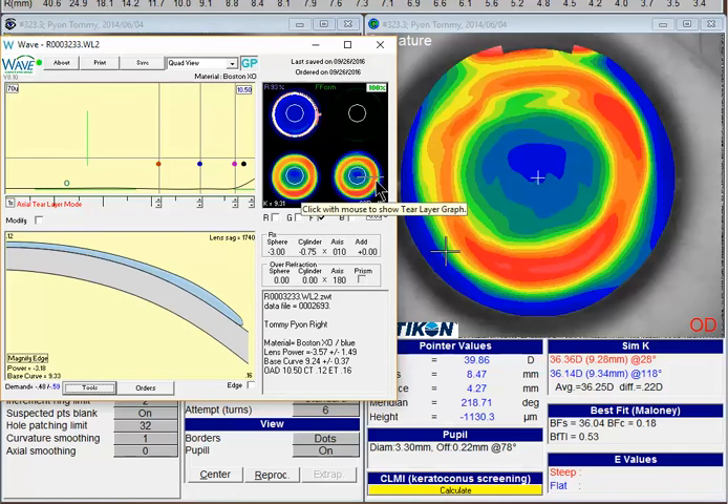And you'll see now that you have a very closely aligned lens all the way around 360 degrees. You'll also notice that the back surface of this lens very closely matches the front surface of the cornea.